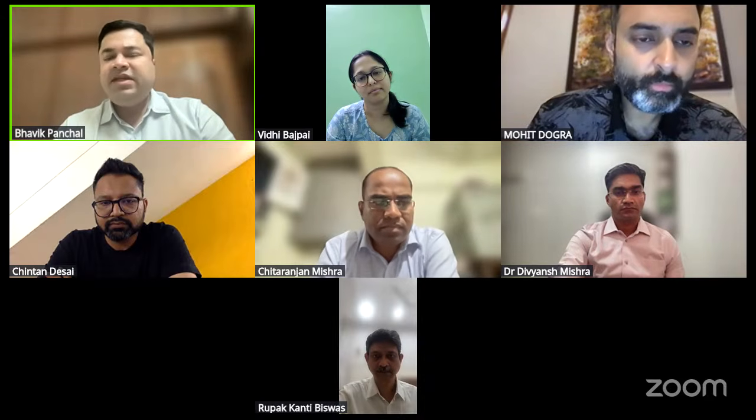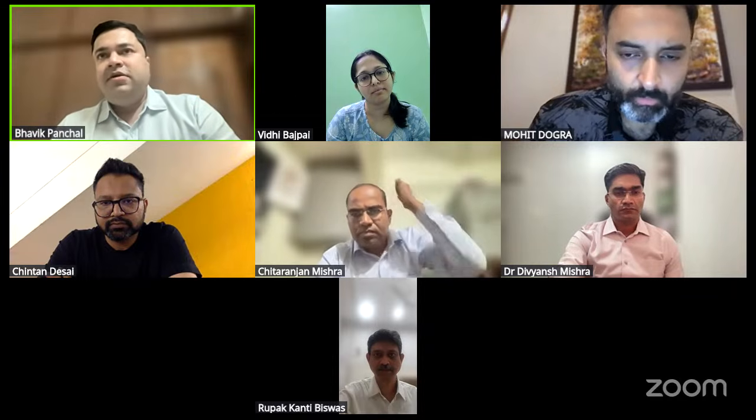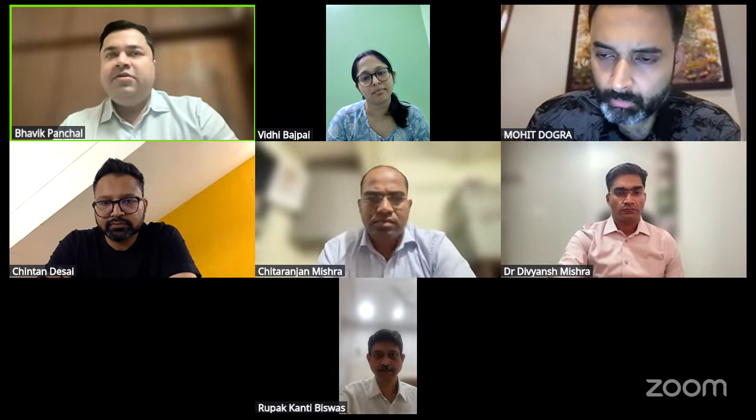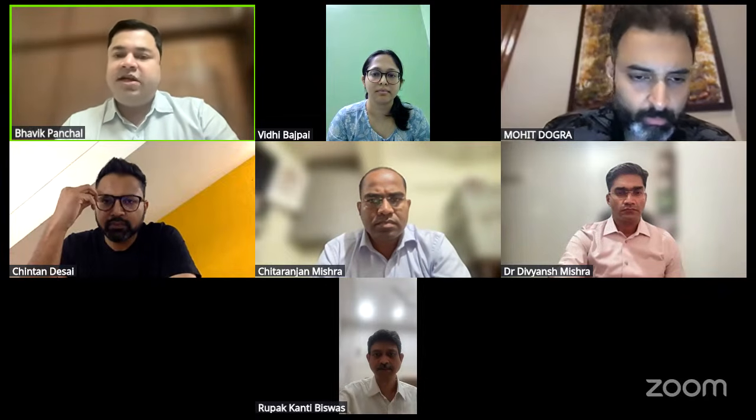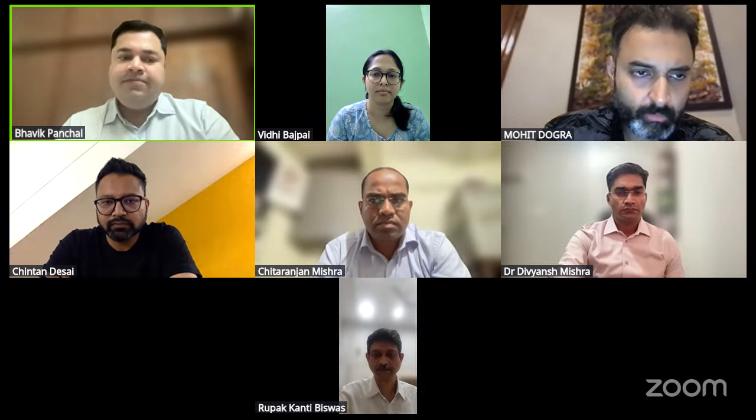Last episode, we spoke about the conventional peel, the technique of ILM peeling. What are the traps in ILM peeling for a beginner? So I want to bridge the previous session with today's session, starting with Dr. Chitranjan. The question to you is very straightforward: in your practice, what are the key indications for choosing an inverted ILM flap over a conventional one, especially in large or chronic macular holes?